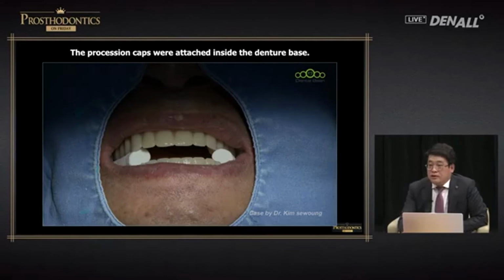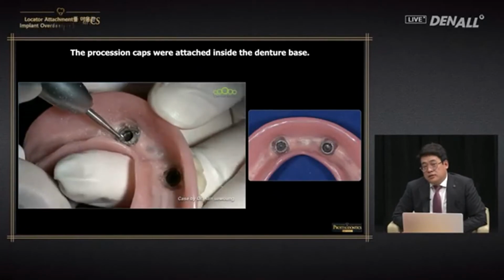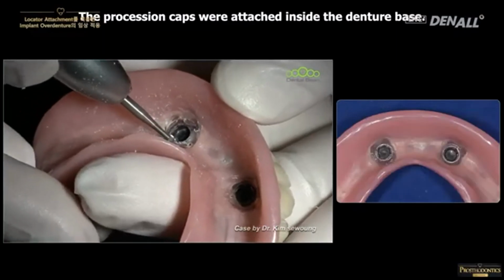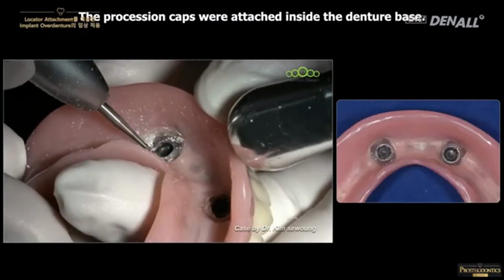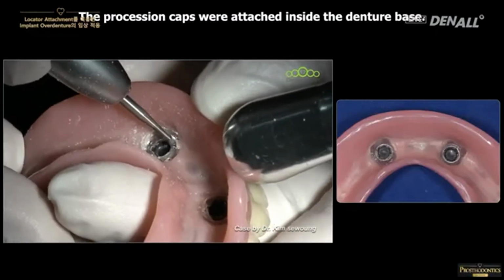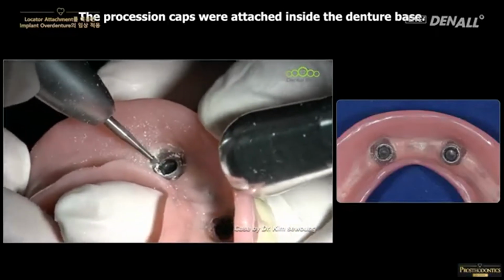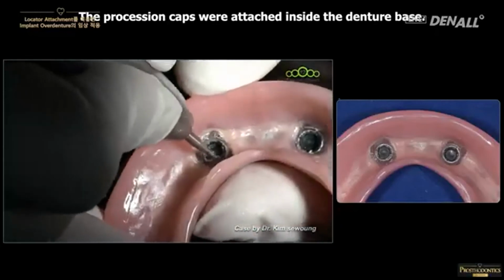When you remove the resin, once it hardens, at times the white silicone ring comes out together or it remains within the oral cavity. You remove that as shown in the video clip using a round burr. I've shown you an illustration about it, and then you trim the surrounding.